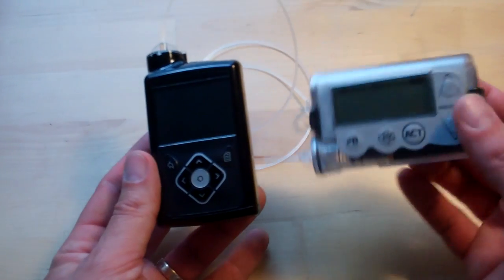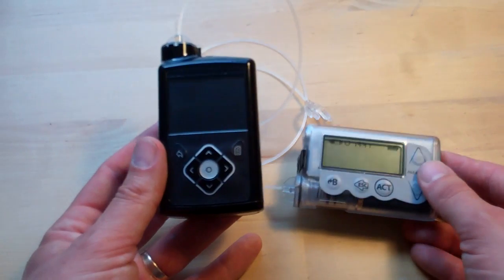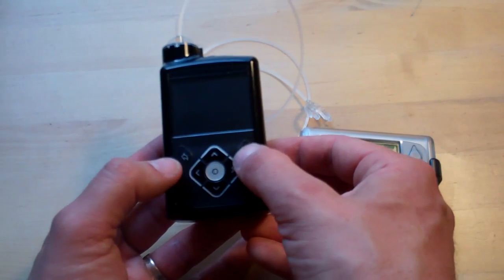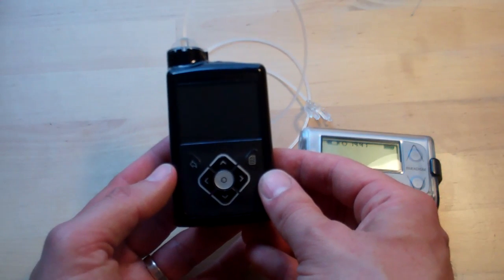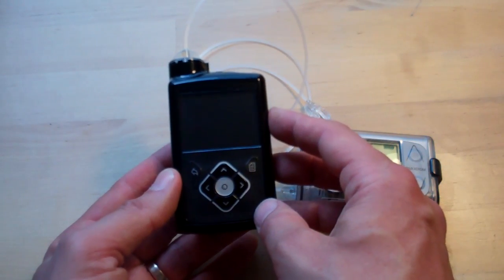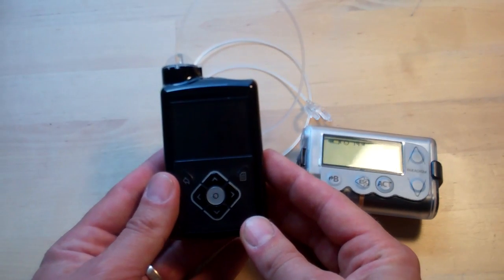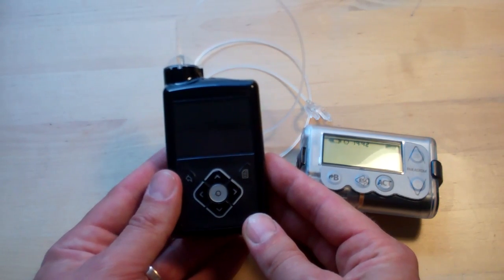A couple of obvious changes: they've changed the orientation — it's gone portrait rather than landscape — and they've included a lot more buttons. There's a four-way controller with a central OK in the middle, and then a menu and a back button. They've really gone overboard trying to rework the user interface, with a great deal of success I think. They've put a lot of thought into it. There are a few things which are going to drive you mad, but they've tried really hard to make the menus logical and to put things where you'd expect them to be.